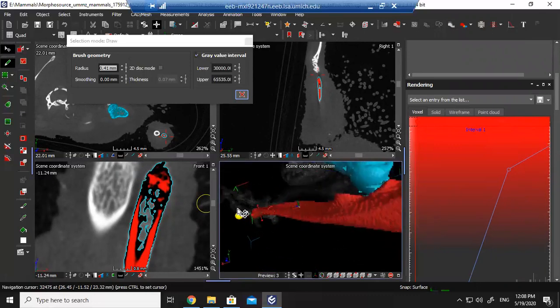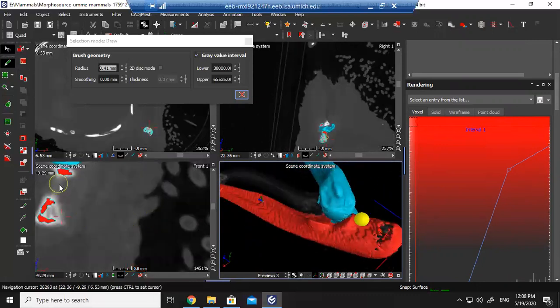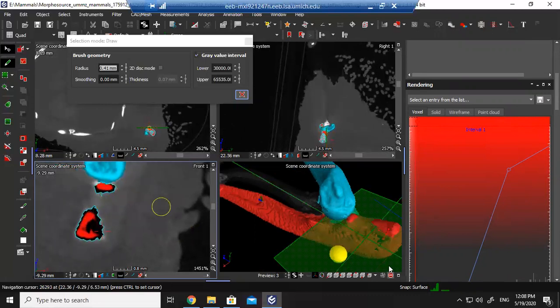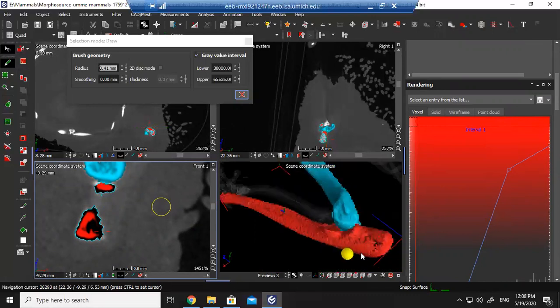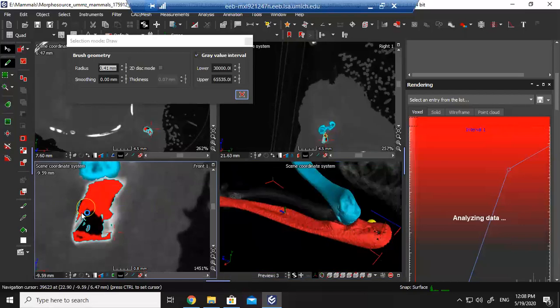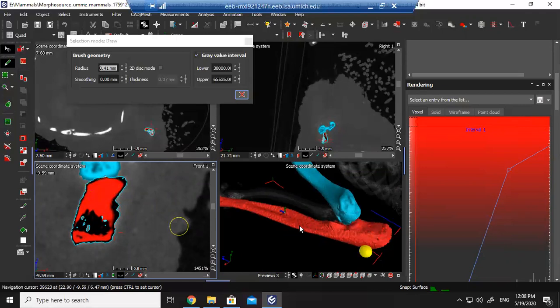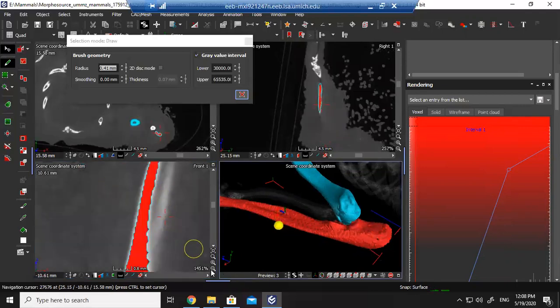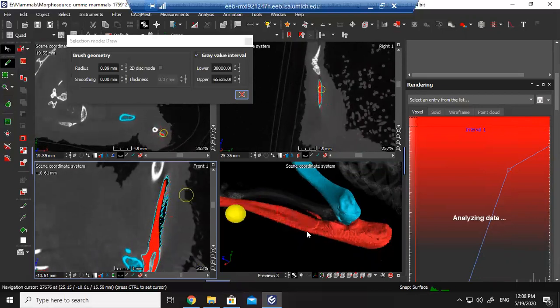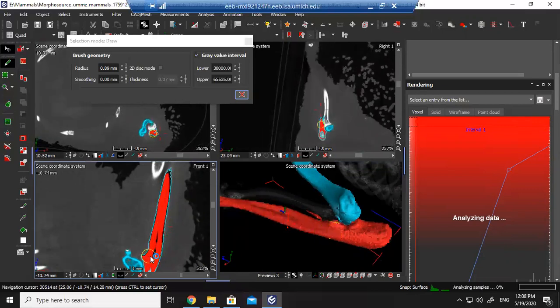Now, if you were doing this, you could do it pretty quickly, actually, using the two tools together. So if you wanted to use just the ROI tool, the region grow tool, to get a quick sense of what the element looks like, and then use the draw tool to fill in those gaps and fill in the rest of the surface, you can do that. It will allow you to go pretty quickly, and you can zoom out a little bit. You can change the size of the ball here and then quickly fill in any gaps that might have been created from the region growing tool.